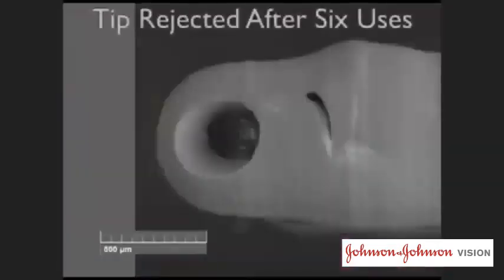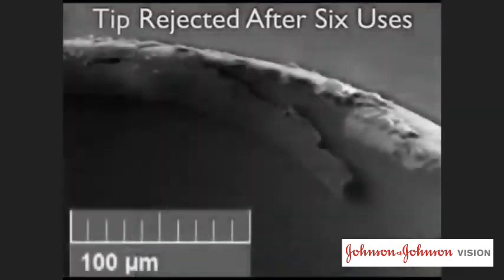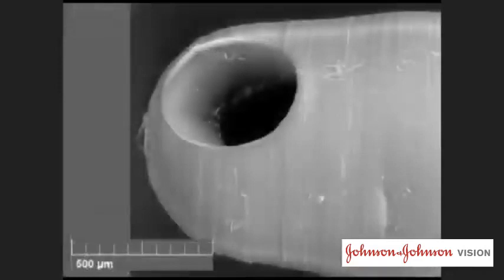Tips rejected due to visible damage prior to 10 uses typically showed large tears in the silicone sleeves. Beneath these tears were equally impressive burrs in the opening of the metal tubes. Last, we examined a new and unused tip.